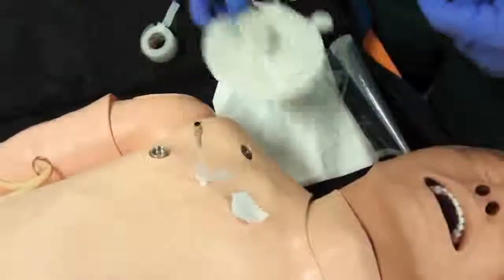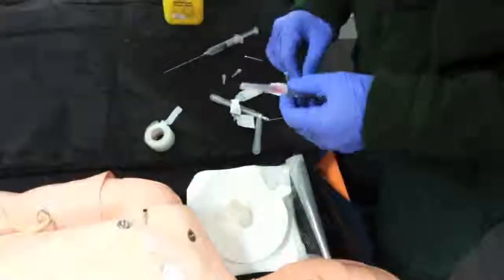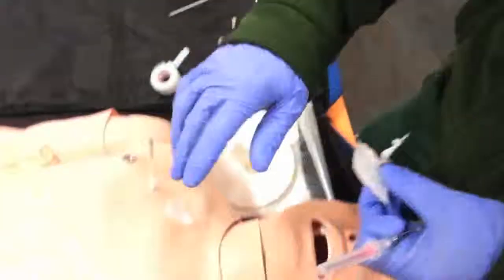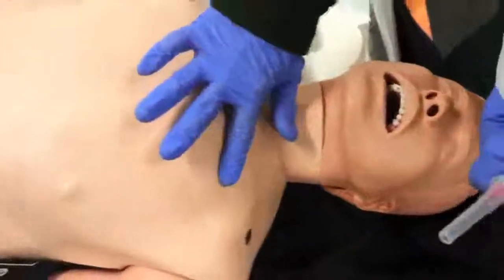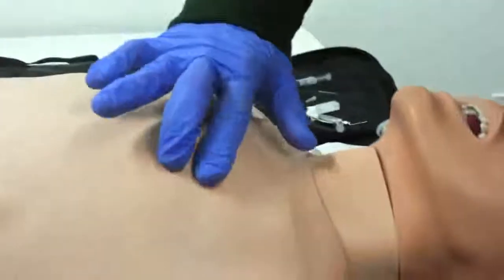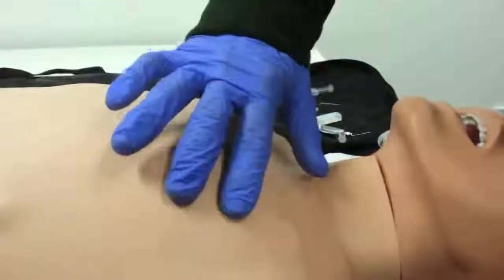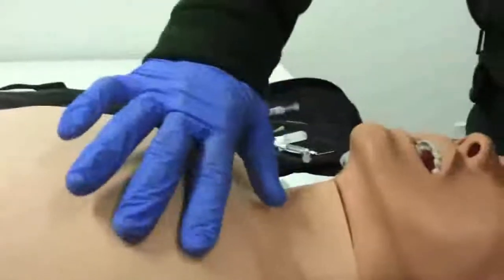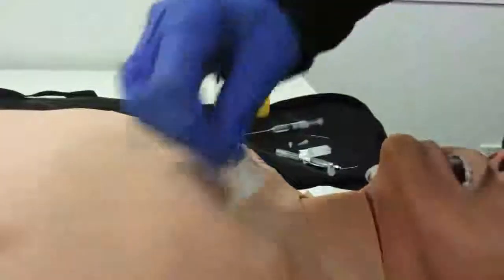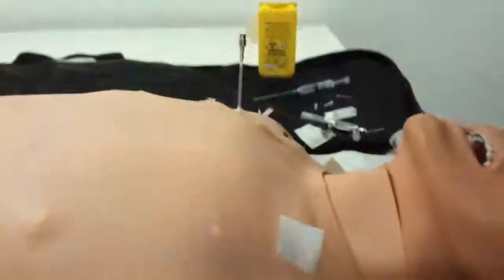I'm now going to take you through decompressing using a needle. Same process: identify your landmarks over this side, clavicle, work your way down, second intercostal, over the second rib, in between the second and third rib there, mid-clavicular. A little tip is that it's actually more lateral than you would think. Using an aseptic technique again, clean the area.